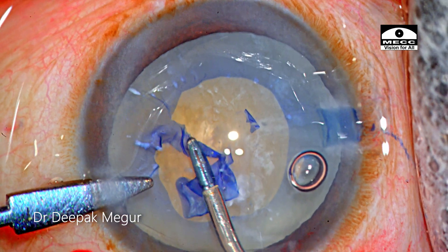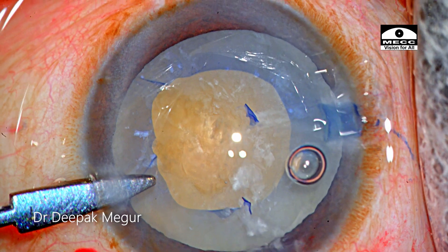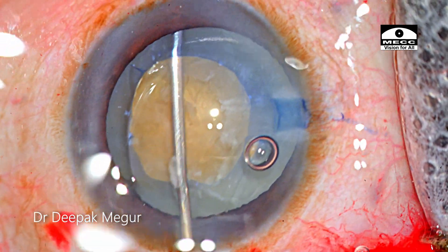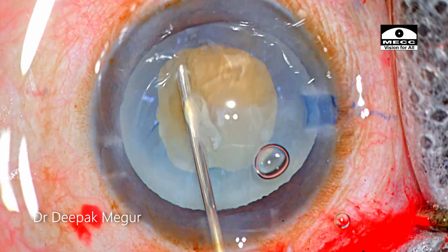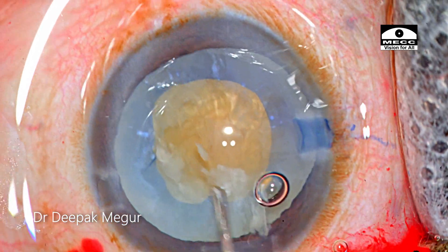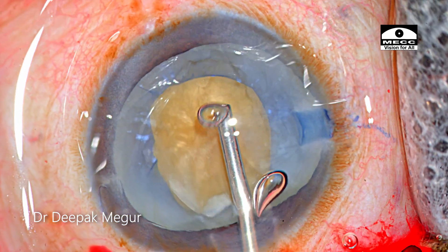The message is: whenever we have a central plaque, it's much easier to deal with. We need to work around the capsule and avoid the plaque areas. As soon as we are out of this range, the healthy capsule is extremely easy to tear. So we now have a decent-sized circular capsular opening. Let's move into emulsifying the nucleus.